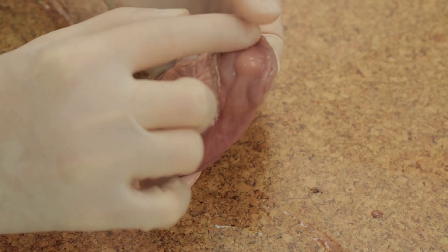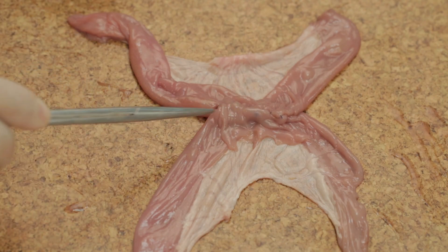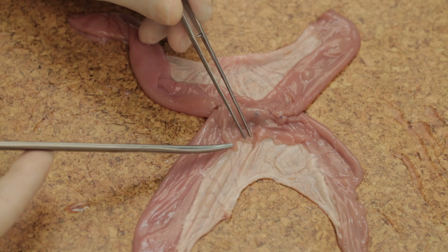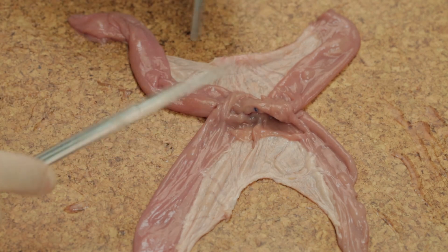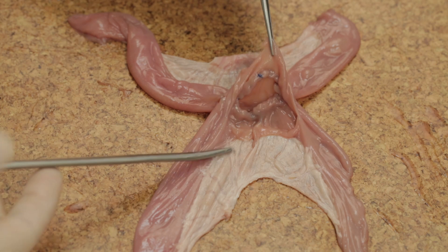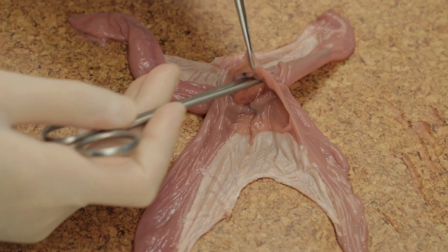A donut of sutures can be felt. You can test the integrity of your anastomosis by incising the bowel and examining the anastomosis from within. As can be seen, there is a wide anastomosis between the two segments of bowel.